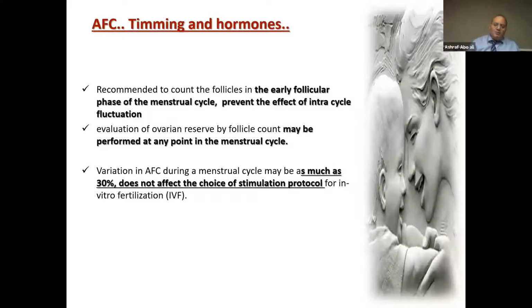But if your patient is coming late and she is in a hurry and you have to go on for stimulation, you can count it, but you should know that there is a fallacy of around 30%. And this doesn't normally affect the choice of a stimulation protocol for in vitro fertilization.